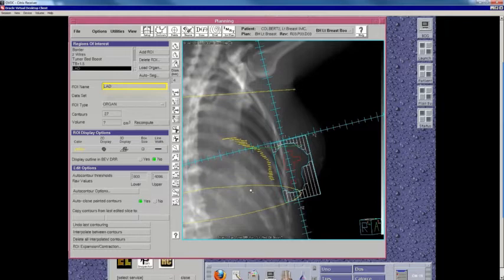Great. So the ASTRO consensus guidelines recommend keeping the 105% hotspots minimal. What would you define as minimal? Yeah, those losers who wrote that guideline didn't really give any good clarity. Sorry, I was the first author, so I can say that. That was something that we really debated a lot because everybody felt like there was a need for some sort of guidance, but there's not really any clear evidence as to what is the most appropriate dose metric for inhomogeneity. And I hope to write a paper on this one day.